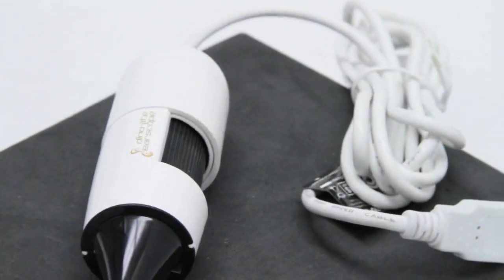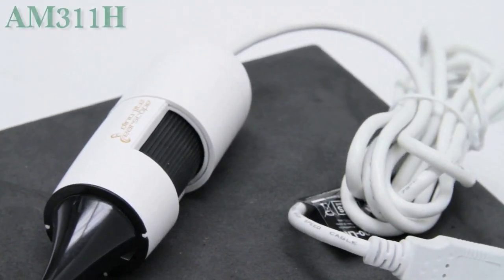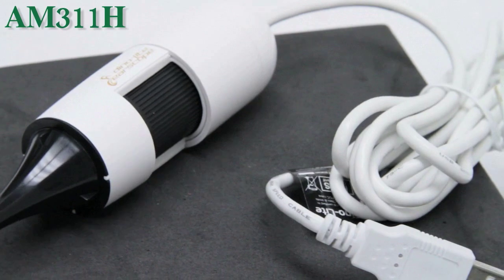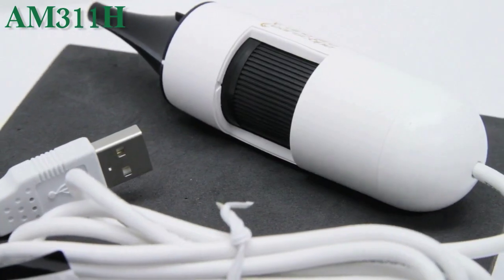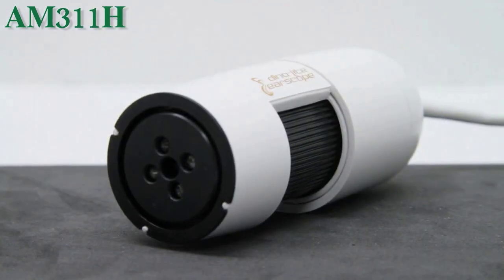Introducing the AM311H. This microscope has 30 frames per second frame rate and a 0.3 megapixel output.